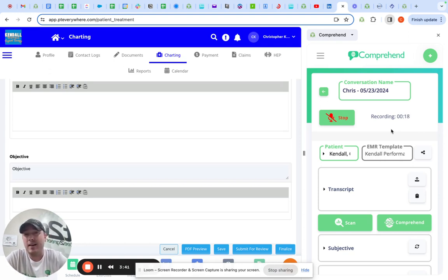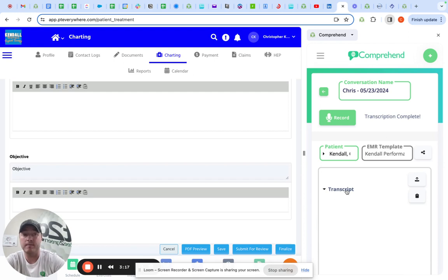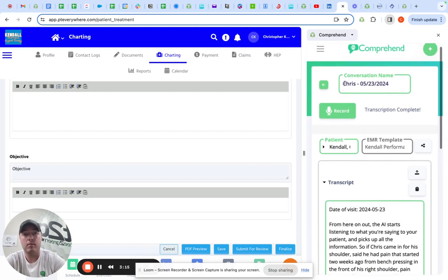It's like a 5 out of 10 pain. At best, it gets down to like a 3 out of 10. This is where I would dive a little deeper into the subjective history. You could ask as many questions as you want, and as you're going, the recording is going, it picks it up and puts everything into the transcript. You could stop and start as many times as you like. It shows you whenever you hit stop, audio gets uploaded. It's all in here. You could let it run.